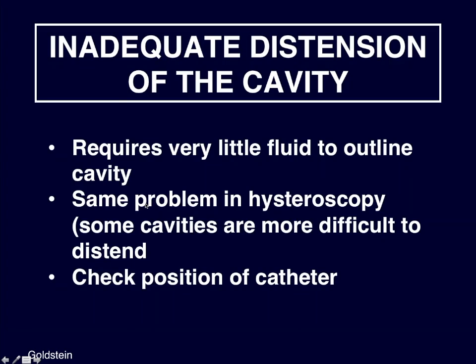It is a weapon. It causes pain. It causes bleeding. This is a cervical stabilizer. It is a wisp of an instrument. It has one notch on the ratchet. It doesn't cause pain and bleeding. It's a little bit like saying you need a shot. Do you want it with a 14-gauge needle or a 25-gauge needle?